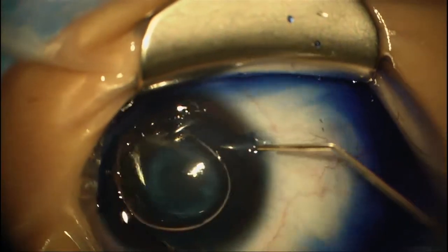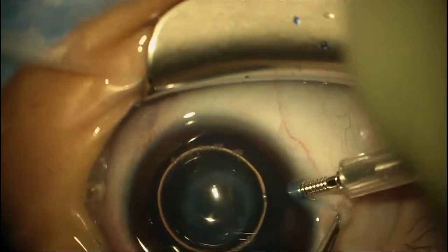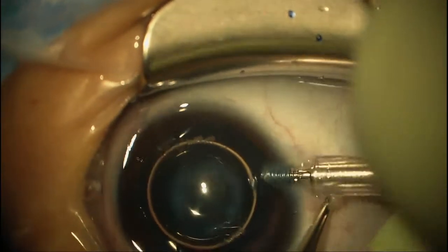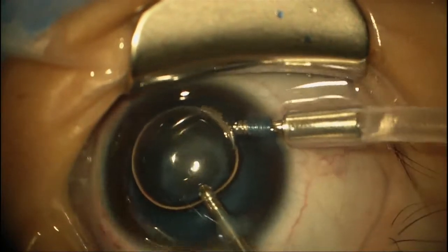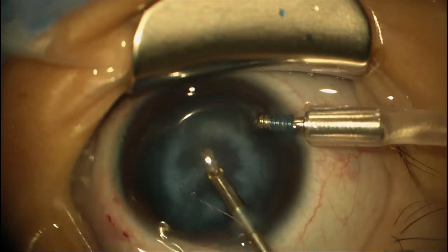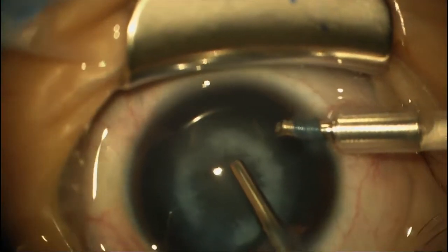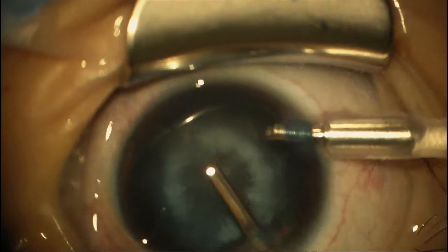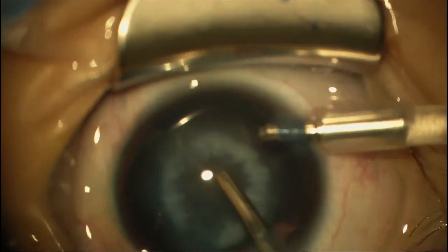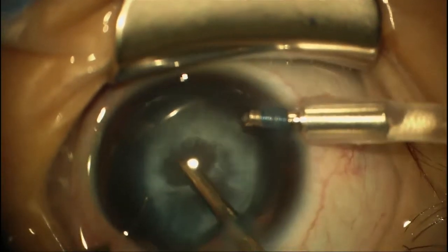Now we'll wash the stain out and insert our anterior chamber maintainer. To remind you of the settings: we've got 250 on our cut and maximum 250 on our aspiration. We've cleaned out the rest of the stain, and now we'll do the capsulotomy — we're just going to use the minimum aspiration that it takes to engage this capsule.